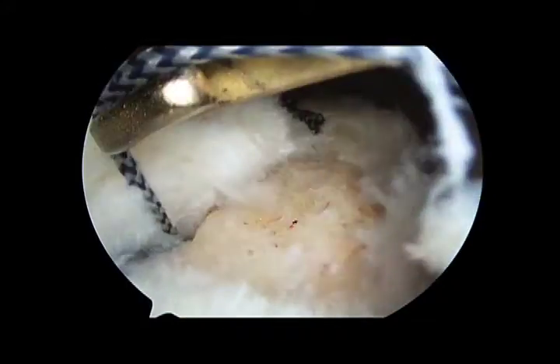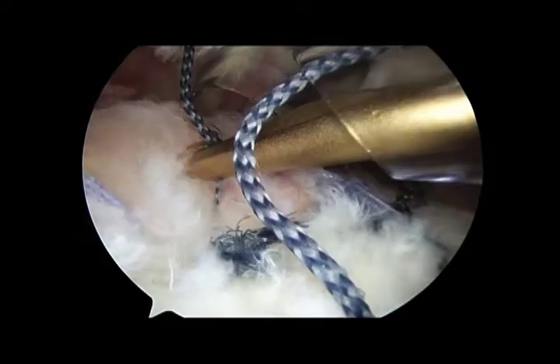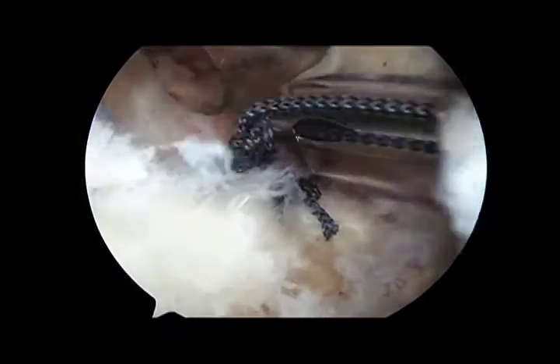Both limbs of the anterior suture from the posterior anchor are then retrieved out the anterior cannula, and the knot is placed and secured anterior to the previous knot. This completes the modified Mason-Allen suture configuration, linking the two anchors together.